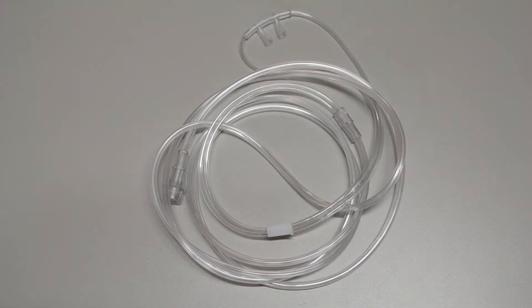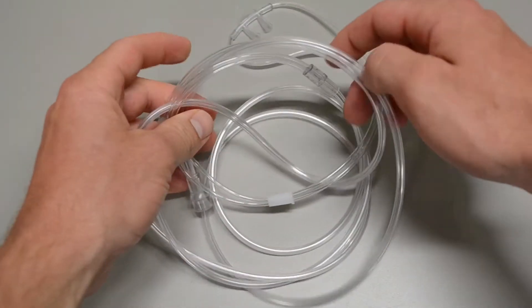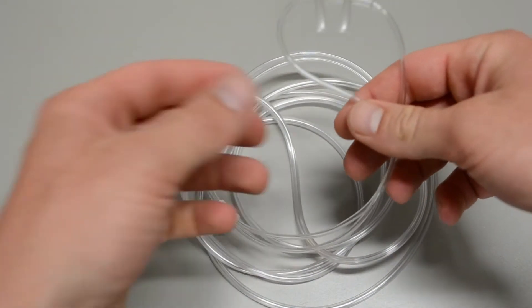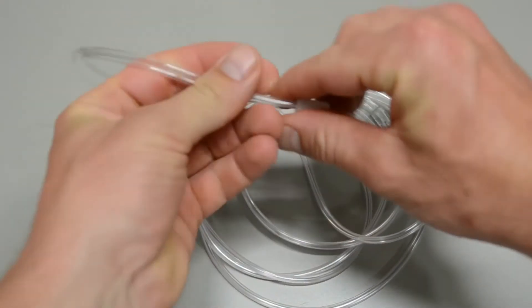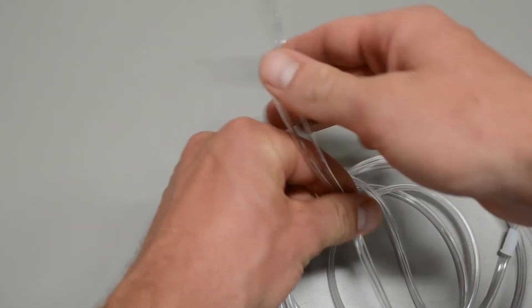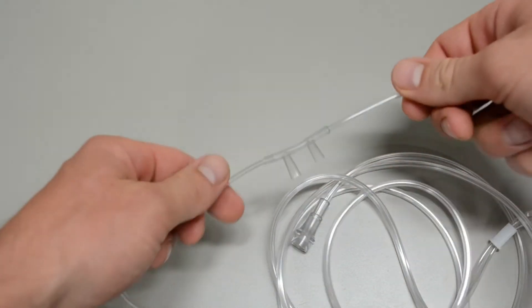Here we have a nasal cannula, sometimes you'll see it abbreviated NC. The only real components you need to be familiar with when you open it out of the package—these are obviously single-use—are this little slide. This allows you to cinch it underneath their chin. We'll talk about that in a moment when we demonstrate it.